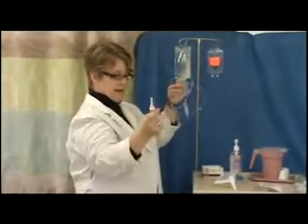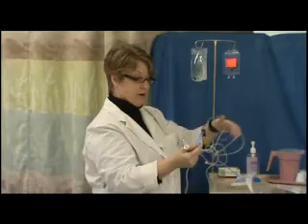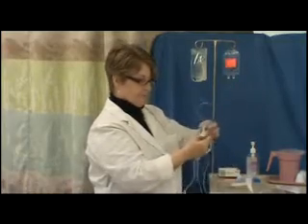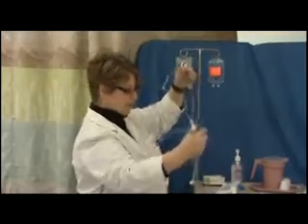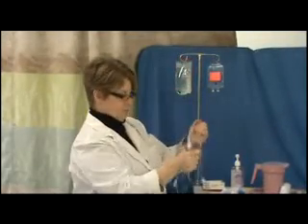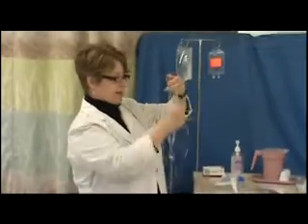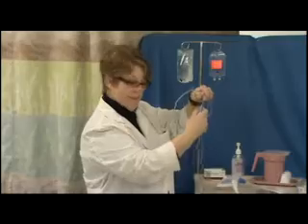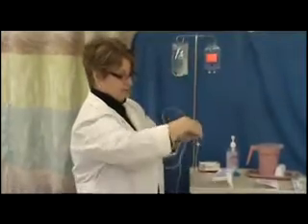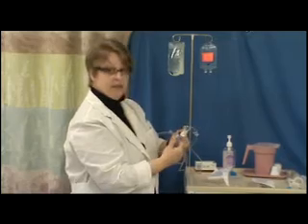Now keep in mind, the outside of this won't remain sterile, but the inside of it is sterile. People's bloodstreams are sterile, and this medication will be running into a person's bloodstream. So you want to untangle your tubing. Before you do anything, you want to make sure that your slide clamp and your roller clamp are close up here. And you want it to be closed.